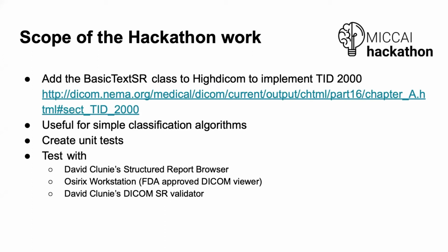which is, again, only used for simple classification algorithms or simple measurement algorithms, like what the bone age of a child is, or a certain very simple measurement. If you want more complicated things, you go to comprehensive or enhanced SR. But I wanted to create something simple here, create some unit tests, and then test it with 3 different tools that I have. There's a structured report browser by the author of the DICOM SR protocol. OsiriX is a workstation that has an FDA-approved DICOM viewer, and it does a medium job of displaying SRs. And then there's also a validator.